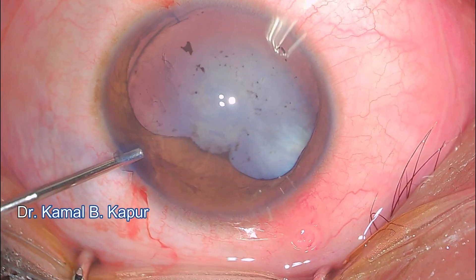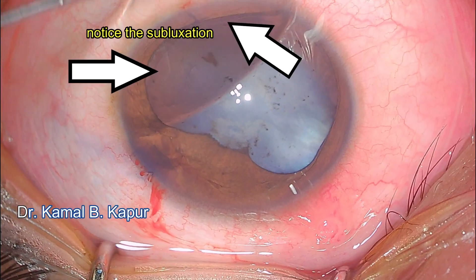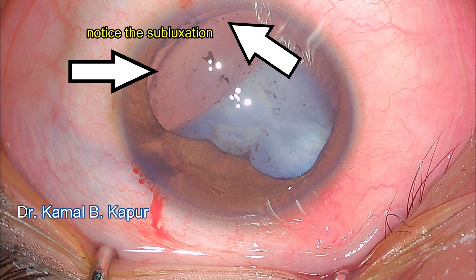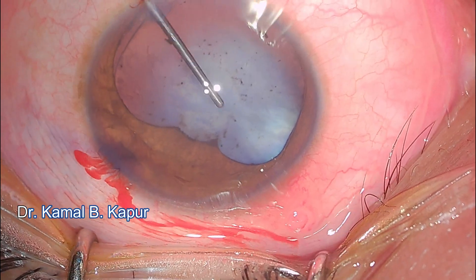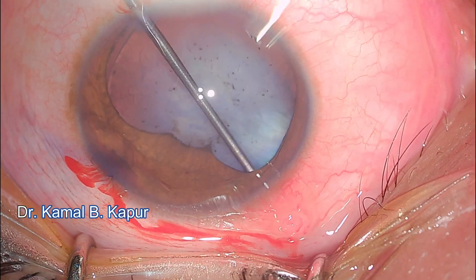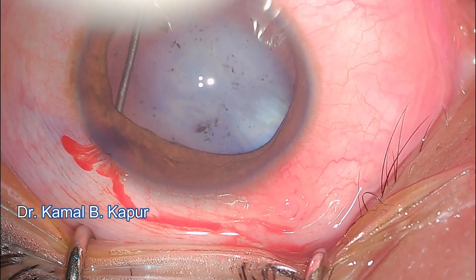The second key step is injecting viscoelastic from one side and moving towards the wound, emptying the chamber with aqueous. Make sure the viscoelastic does not go behind the subluxation. You can see just underneath the side port there is the area of subluxation.